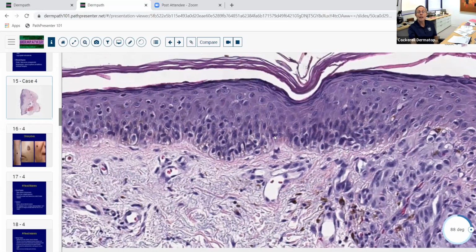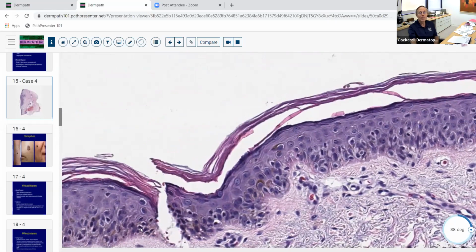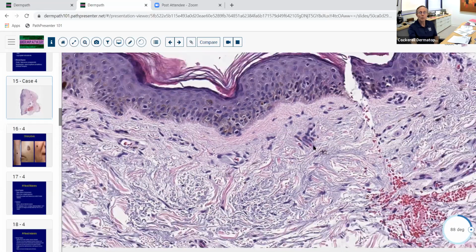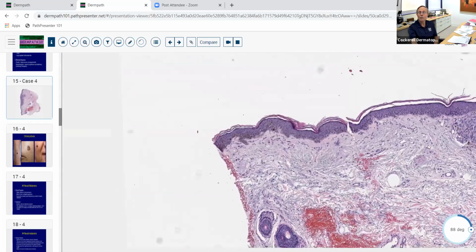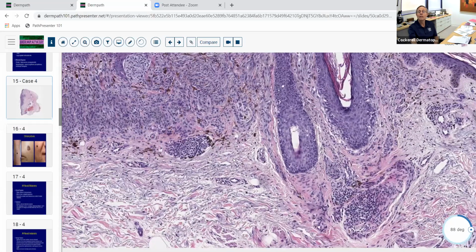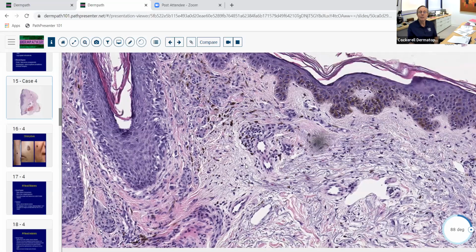And now you've got the poor circumscription. You've got this single melanocytic proliferation extending beyond the dermal component with pagetoid spread out here. So this lesion is not well circumscribed. It's kind of pseudo-symmetrical at low power, but it's actually not symmetrical. It's not well circumscribed. So this is an example of a malignant melanoma with features of a nevus in many ways.